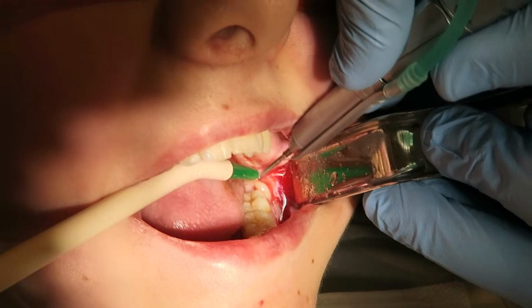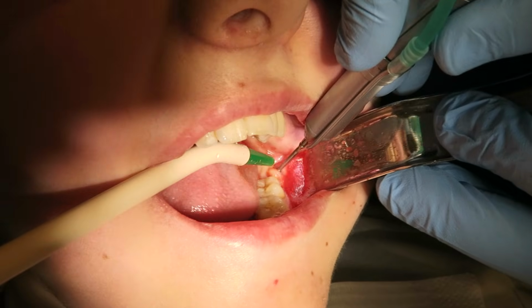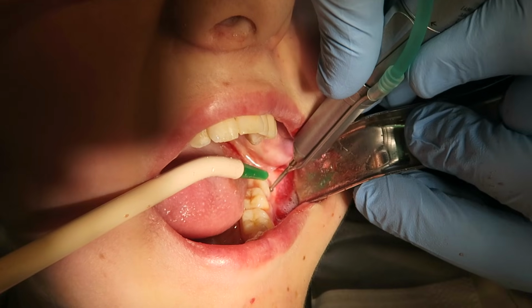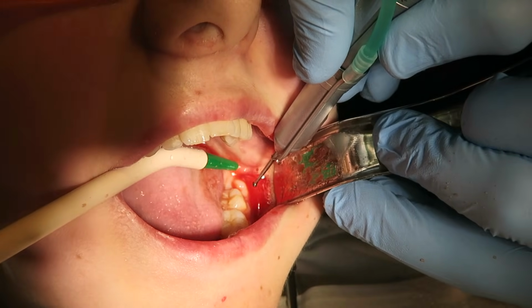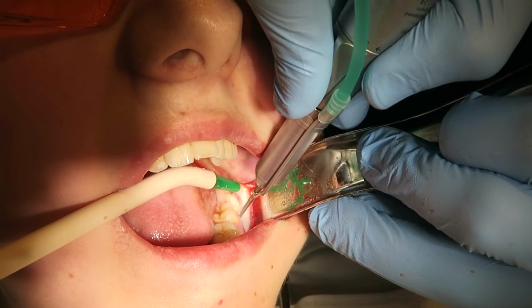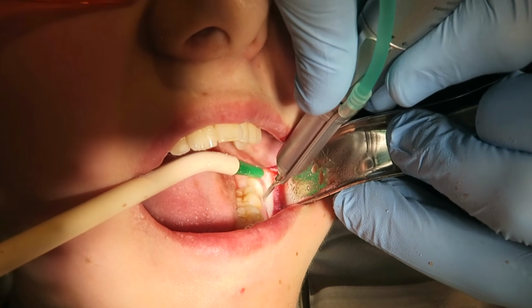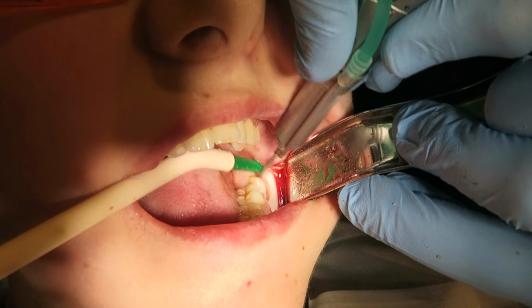Most important thing when you cut, especially when you go around the distal buccal cusp of the tooth, it's better to start from the distal side and come toward you, just in case you slip and cause damage to the lingual nerve, which is very superficial, just below the lingual mucosa. So always cut from distal buccal toward you, i.e. mesial. So plenty of irrigation.